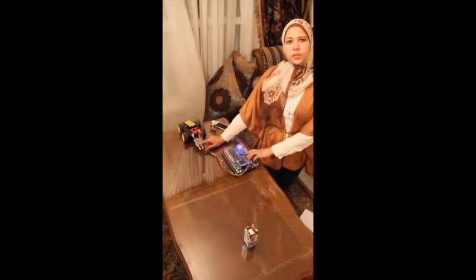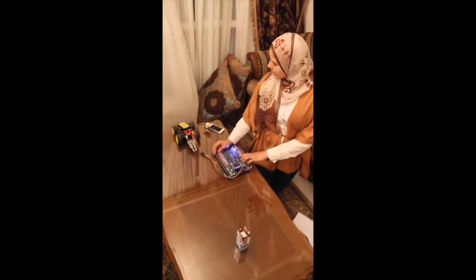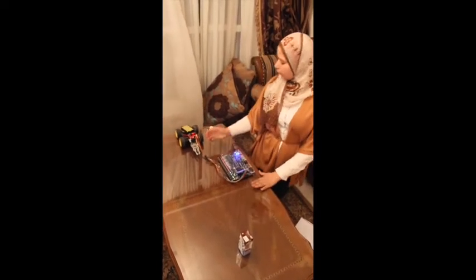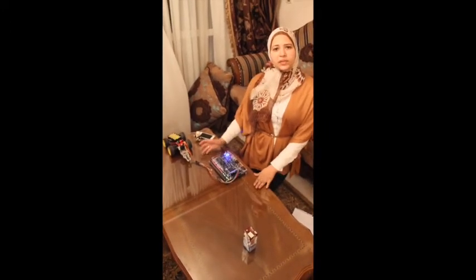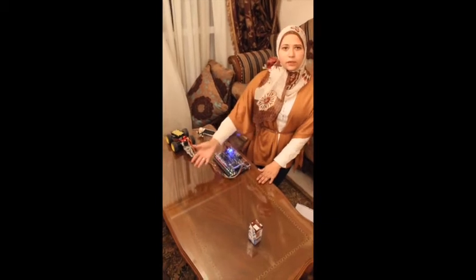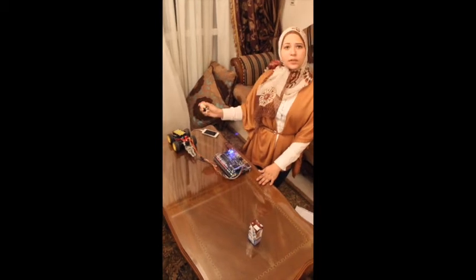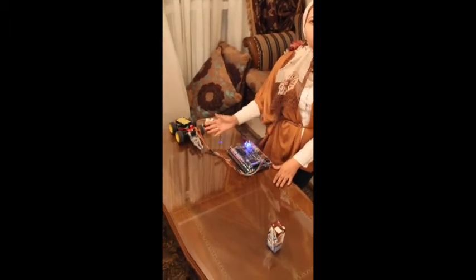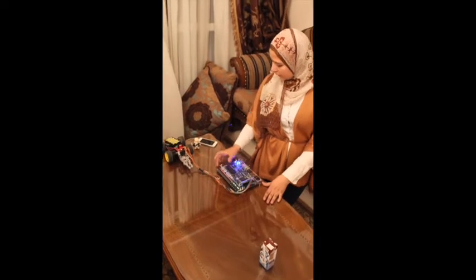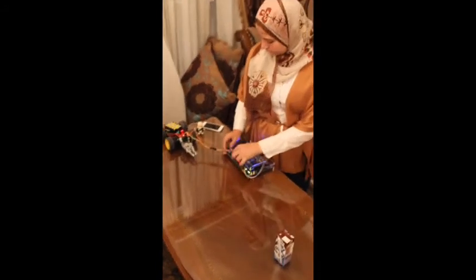And when it opens, it causes a buzz. This buzz acts as a sensor that it opened and closed. And our aim, like Fadi said before, was to help senior citizens, or people with disabilities in general, to grab anything if they can't move an arm or a leg or whatever. So let's imagine that this is our senior man and he wants to drink a juice and he cannot move. What he will do is control our project using the Altera board and these keys. So now I'll show you the practical implementation and an example.